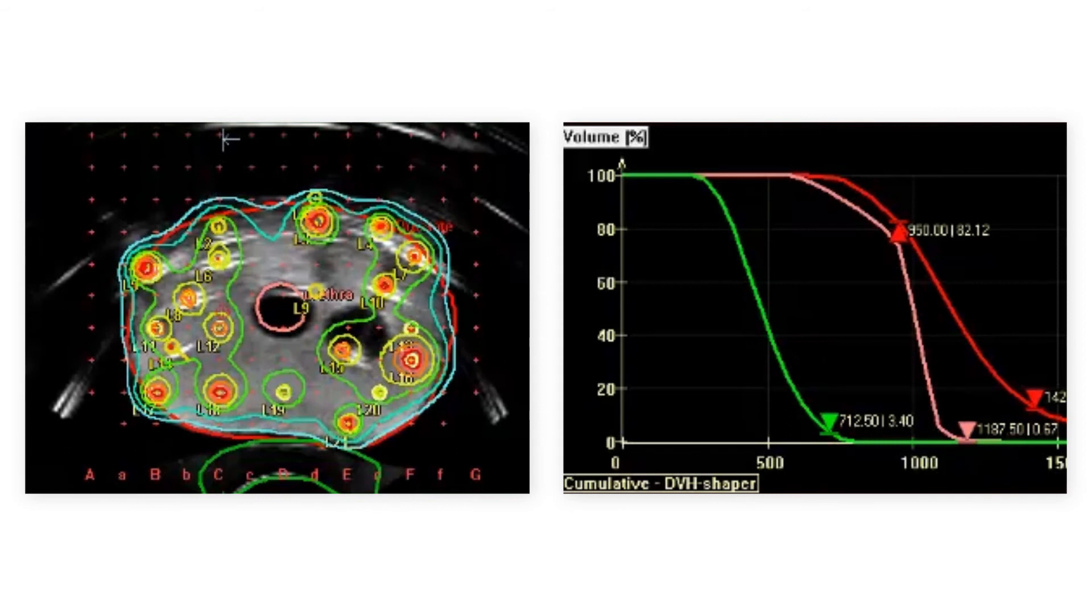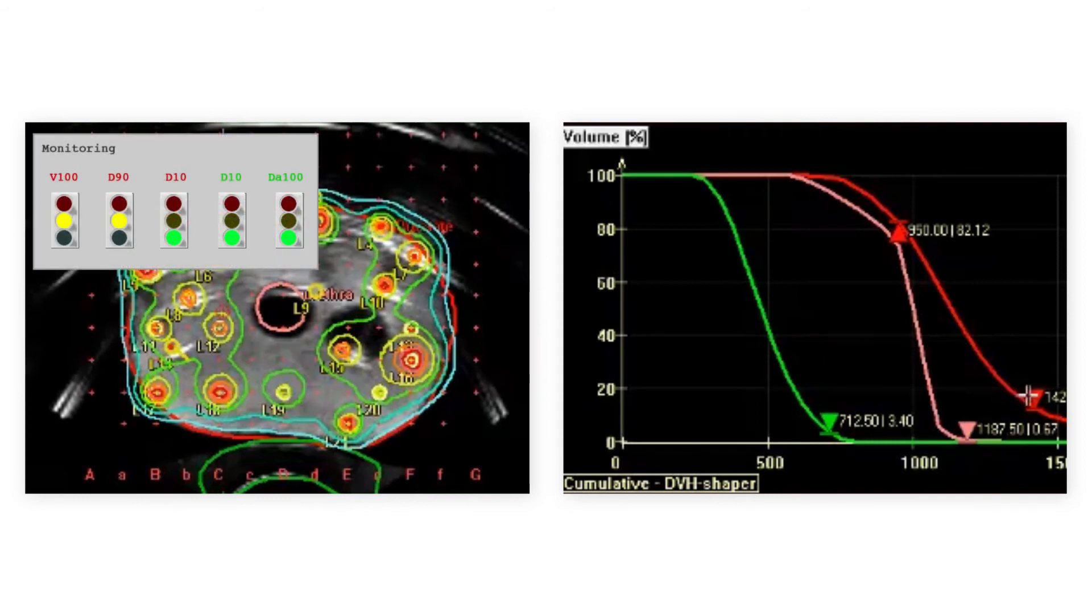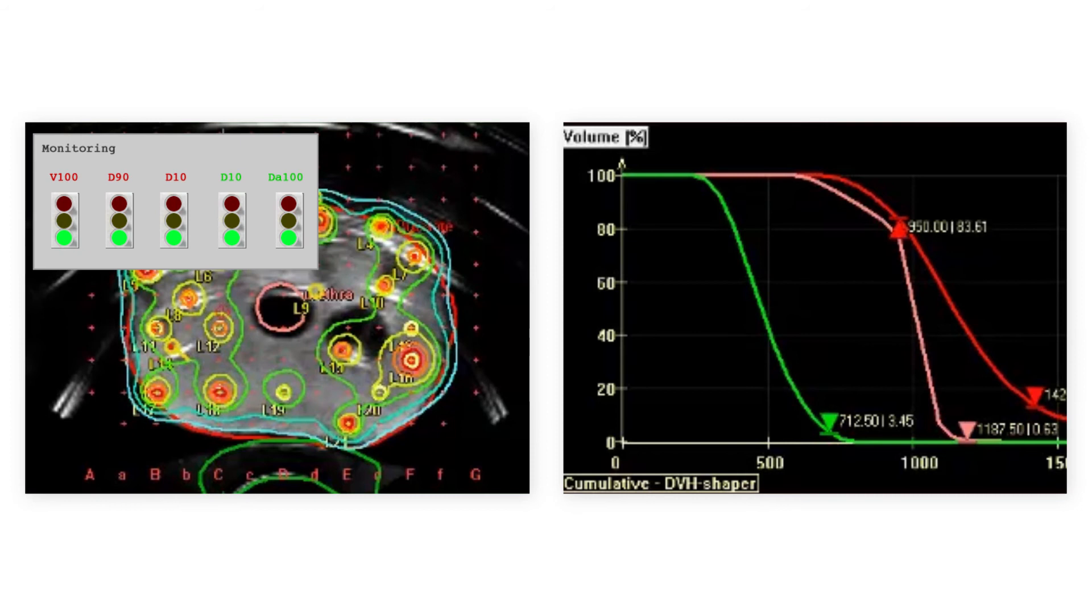The real-time prostate solution allows you to visually evaluate the treatment plan at any moment based on isodose lines, cold and hot spot location, or traffic lights. The seed or dwell positions can be adjusted and the traffic lights will again show you the result.